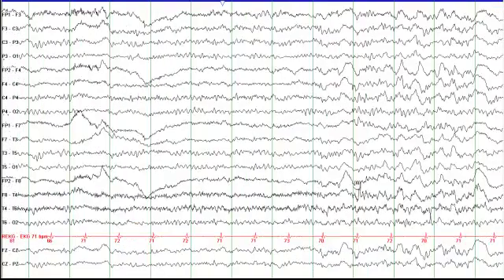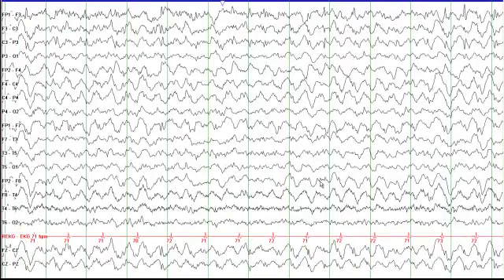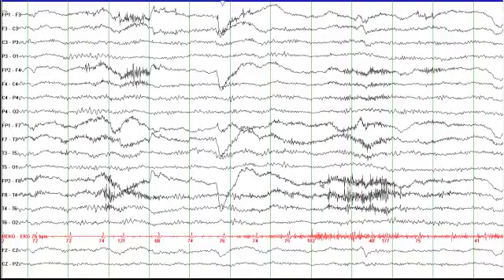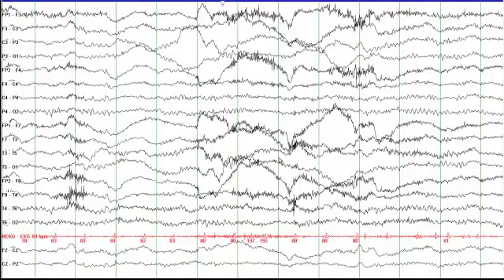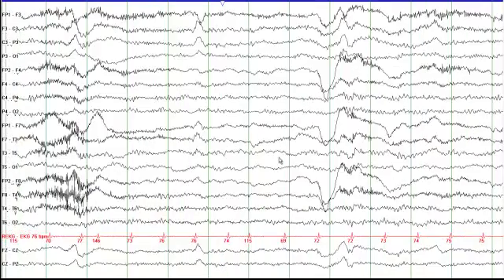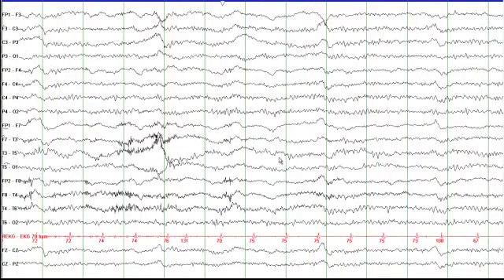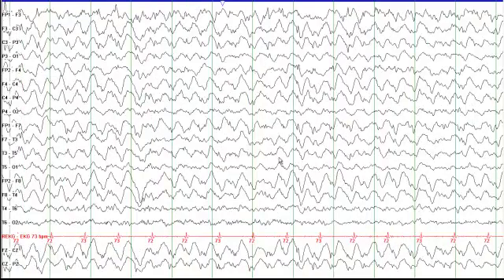Here is another seizure — change in frequencies, changes in amplitude, evolution in the background, no clear lateralization, a beginning and now an end. The take-home message is that electrographic seizures can account for a decreased level of consciousness. To classify an electrographic seizure, you want to see a clear beginning, a clear end, and an evolution in frequency and amplitude.